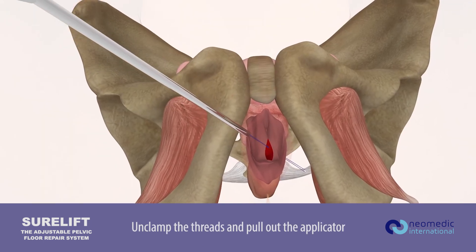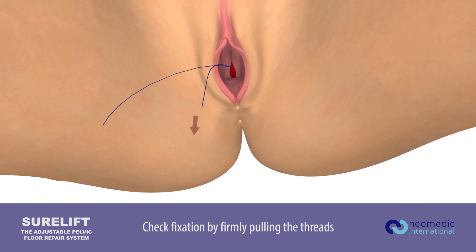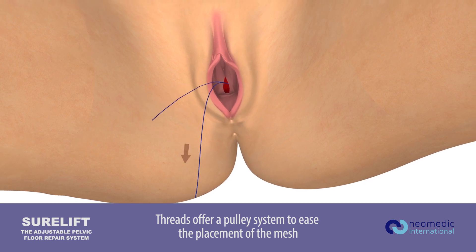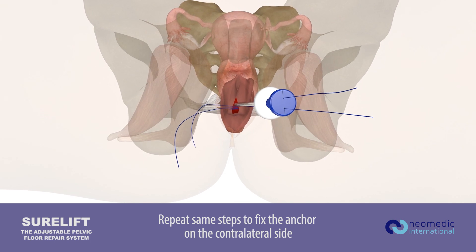Unclamp the threads and pull out the applicator. Check fixation by firmly pulling the threads. Threads offer a pulley system to ease the placement of the mesh. Repeat the same steps to fix the anchor on the contralateral side.